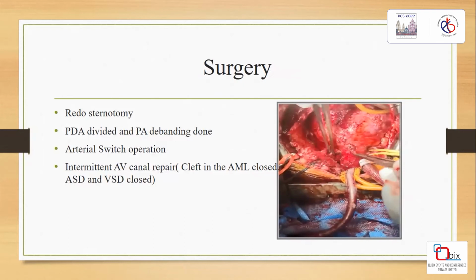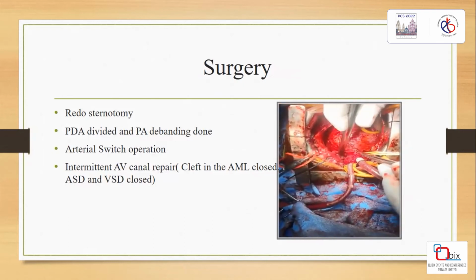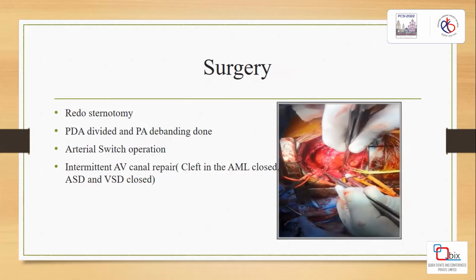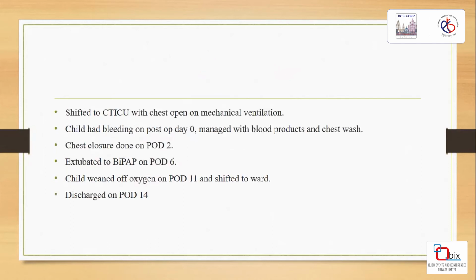The anteroposterior relationship of great vessels. So basically, this is another arterial switch. We've been doing quite a few of late, very complex anatomy. There's a lot of bypass time, so we should not do extensive dissection across the Lecompte maneuver. If you can get the atrium done fast, we'll save a lot of clamp time, and then we'll do the switch.